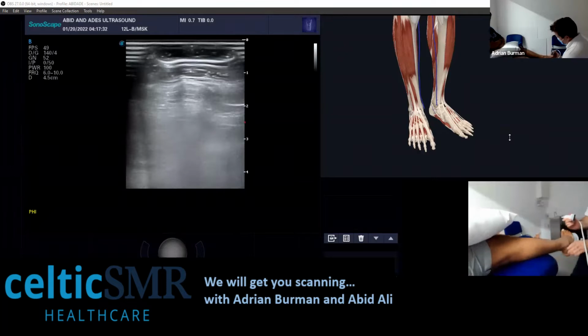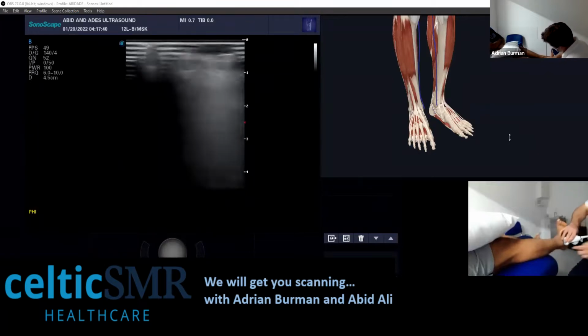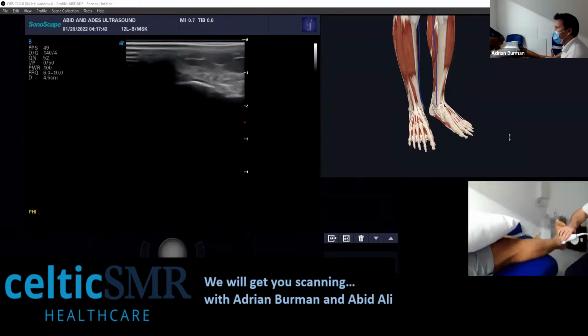Yeah, that's the point. So I tend to dorsiflex. Okay, and it's in this position. It tends to be at the sort of 3 o'clock position if you put your head on the malleolus there.